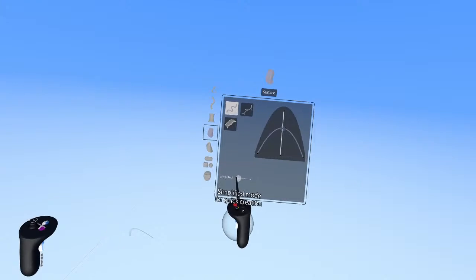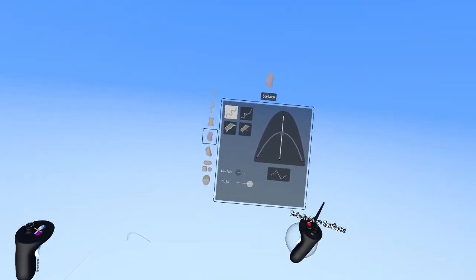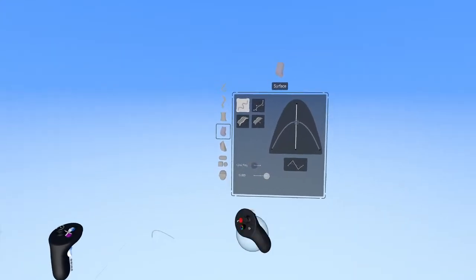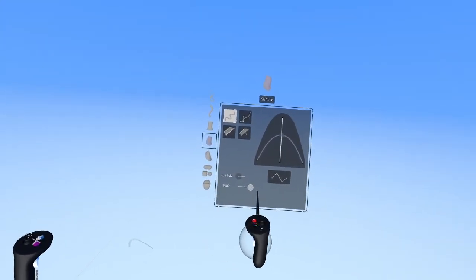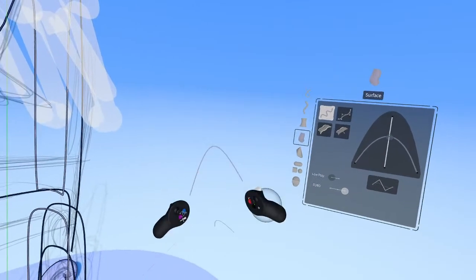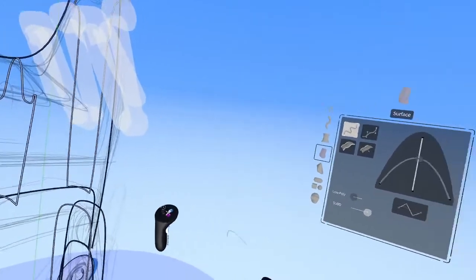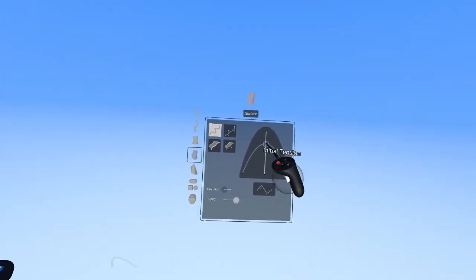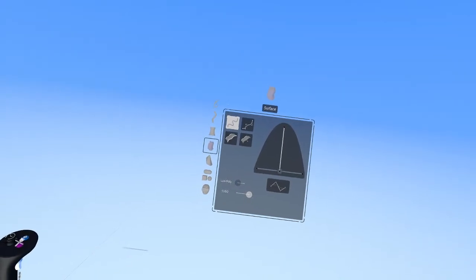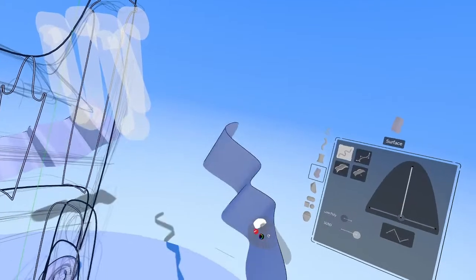First, we're going to go from simplified geometry type and slide it all the way to sub D. You have some new options up here. We're not going to worry about that right now. We're just going to make sure that the geometry type is sub D. The other thing we're going to do is we don't want curvature in our surface. We want to add the curvature later to our surface. So we're going to come up here to the graph and drag the initial tension or the curvature all the way down. So now we have nice flat surfaces to work with.